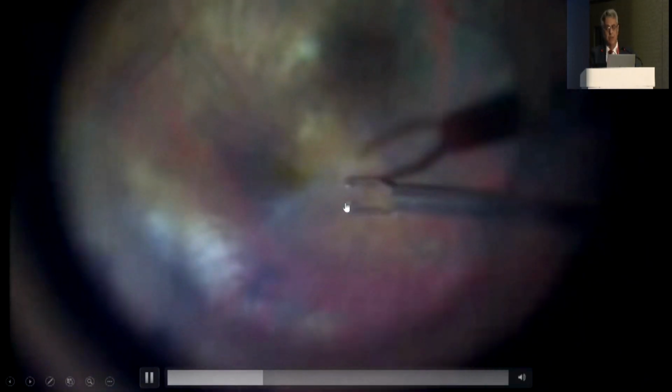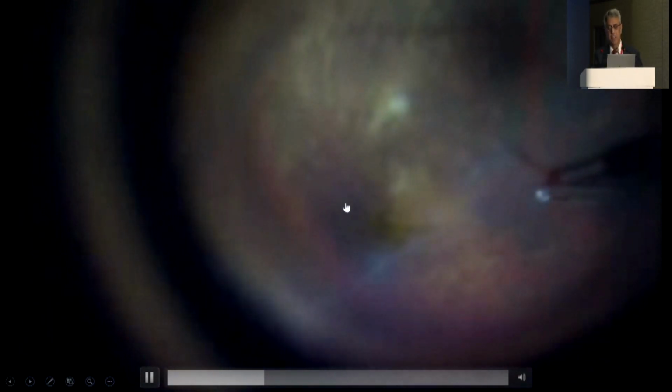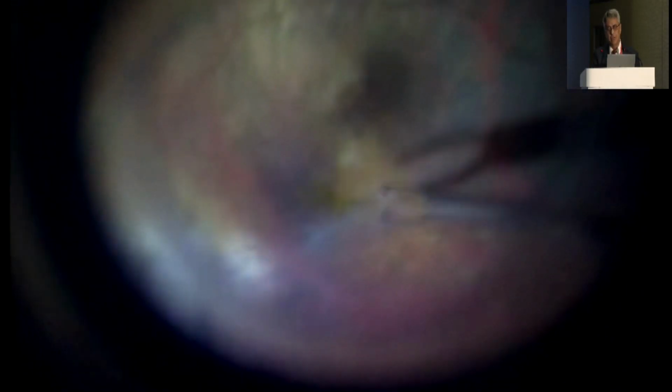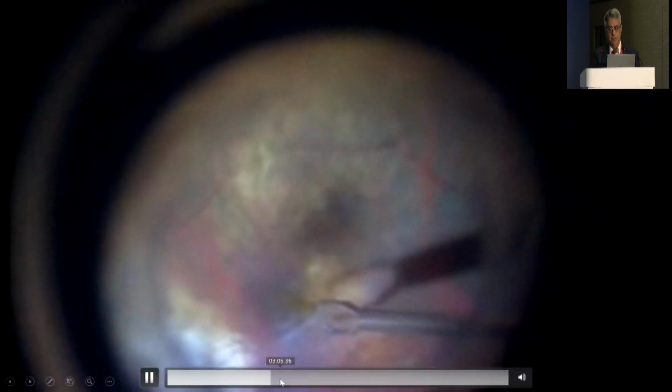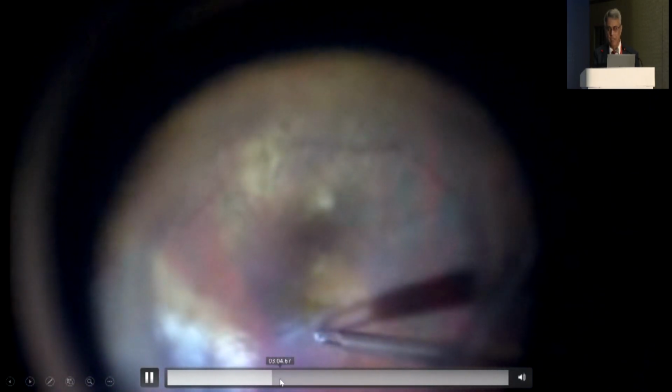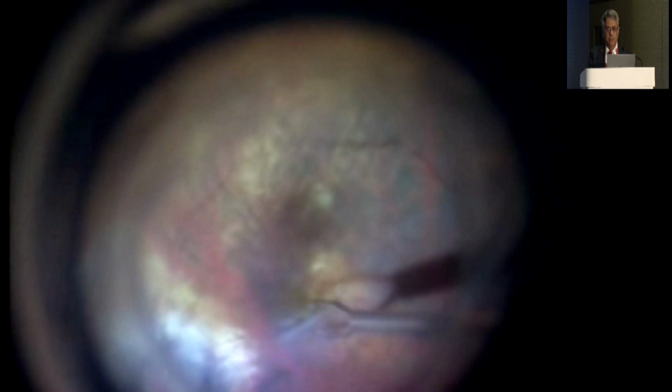This was a patient who had silicone oil removal done after a detachment surgery, but had a membrane. So with a lot of these patients of silicone oil removal, we have to combine it with the removal of the epiretinal membrane, and this generally is not a very difficult job. Sometimes you can do it under the oil also, but if I have planned that the oil has to be removed, then I will do it after the silicone oil has been taken out.